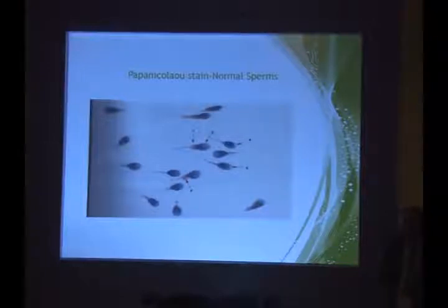For us to know, a sperm head should have a breadth of 2 to 3 micron. It should have a length of 3 to 5 micron. The length upon breadth ratio should be around 1.5. The head should be perfectly oval. The acrosomal area should be 30 to 70% of the sperm head area. The acrosomal vacuole should be less than 1/3 of the acrosomal size.